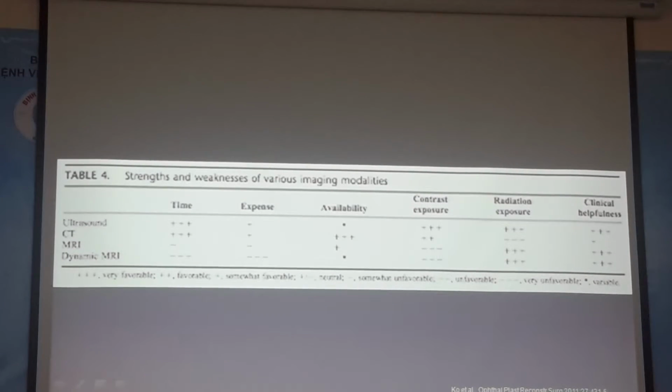And I think that it's important that we remember that just because something is very fancy and new and an interesting technique, it may not always be the best technique to use for a particular problem. And I would say that for patients who I think have orbital vascular malformations, the most useful technique that I have to evaluate them with is, yes, CT, because I told you that CT is my first study for patients with orbital disease, but then I go to ultrasound after that. I don't go to these fancy MRI techniques, because almost always I think I can get just as good, if not better, results with the ultrasound and CT, and I don't need the MRI when I think it is an orbital vascular malformation.